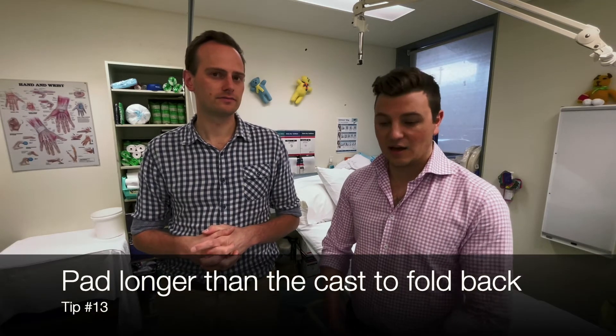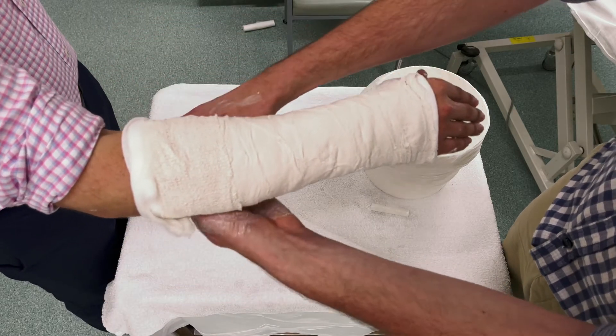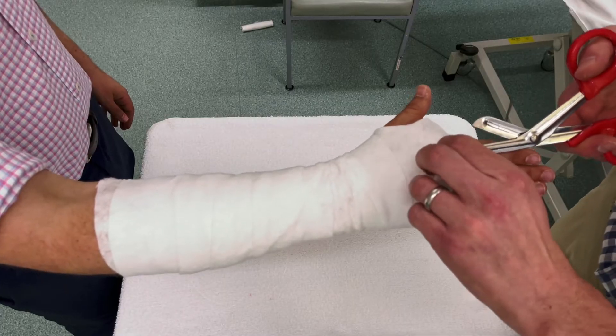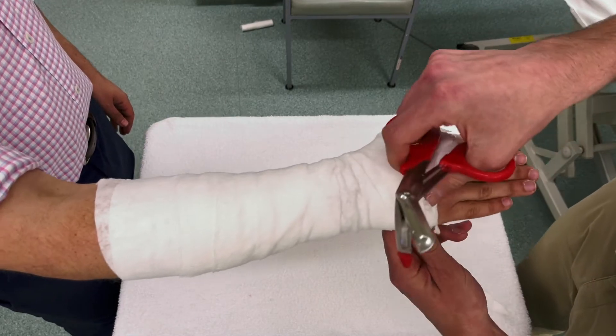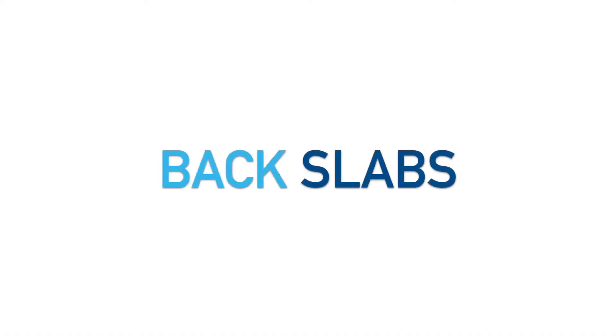Another tip is to extend the Webril longer than where the cast will finish — for example up to the cubital fossa — then make two cuts with scissors on either side to fold it back over the top. This makes the edge neater and more comfortable for the patient, and it acts as a visual marker of where you want the plaster to finish. In the hand especially, it's very common to go too far and restrict finger movement. Once you see skin, you know not to keep plastering over it.